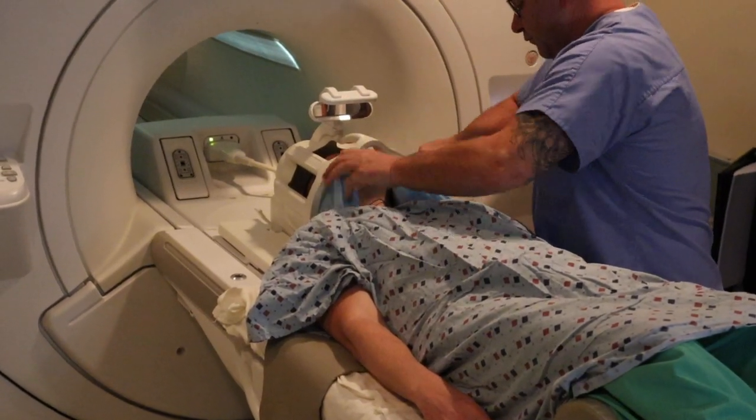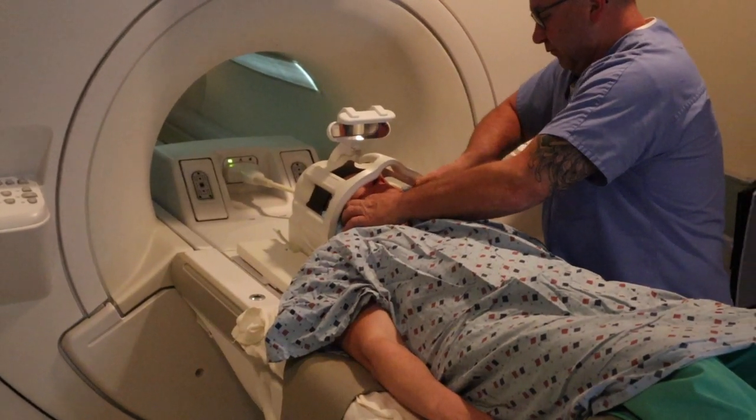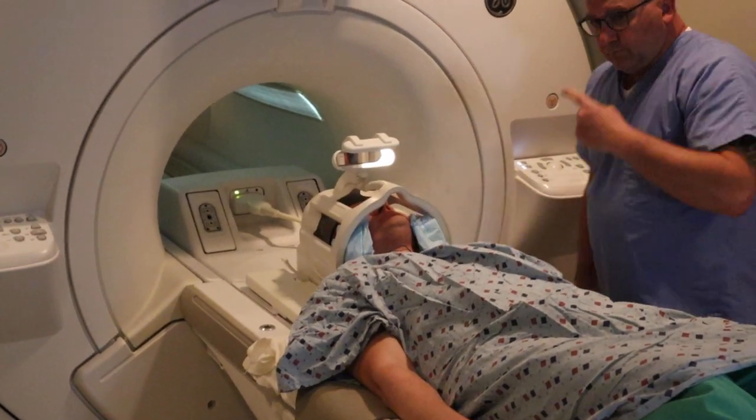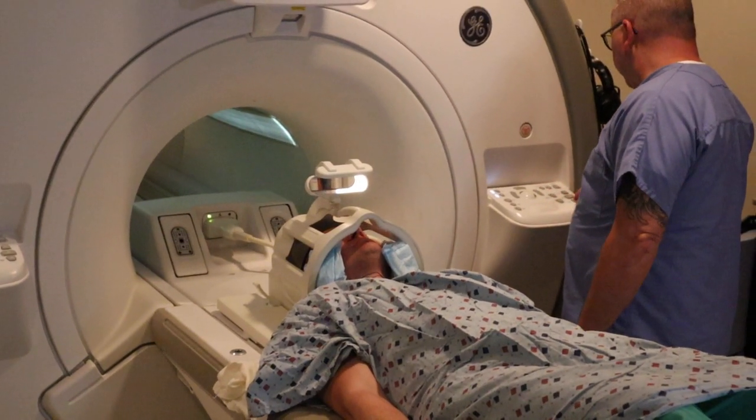The patient now has ear plugs in, we make sure the patient can see out, and we put some stabilizers to the left and right side of the head. This allows the patient to be comfortable and limits any motion during the scan.